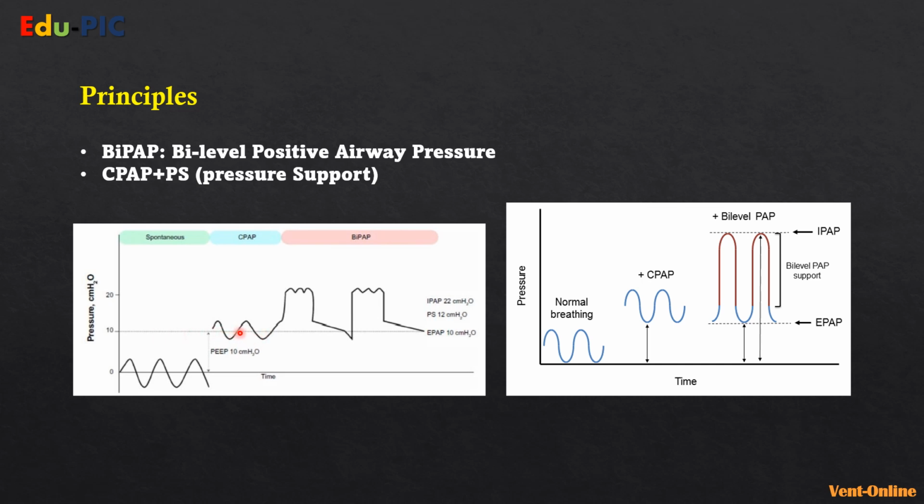Then maybe if you're not achieving the best oxygenation and you need more pressure, but you still need the patient to breathe and be able to get chest wall movement, then maybe if you go with what you would expect from a ventilator, but without invasive ventilation, which is having a delta P driven by your machine, or having a pressure gradient that goes with pushing air in and then allowing for air to go out, then that basically should improve your ventilation.